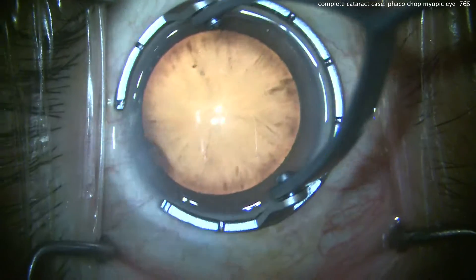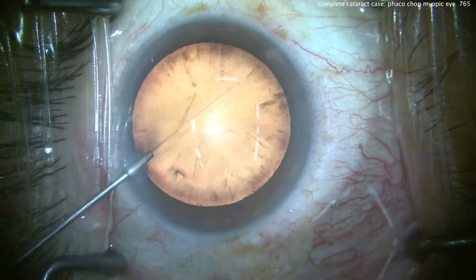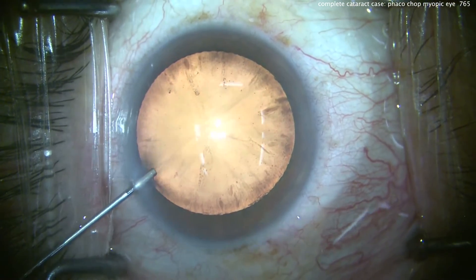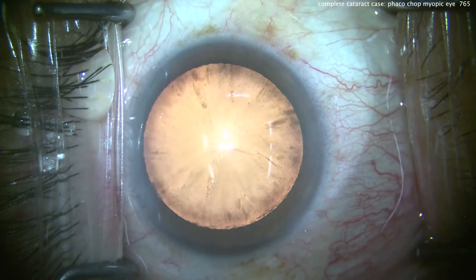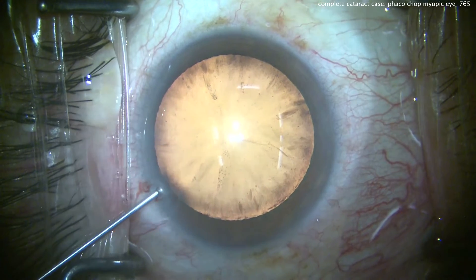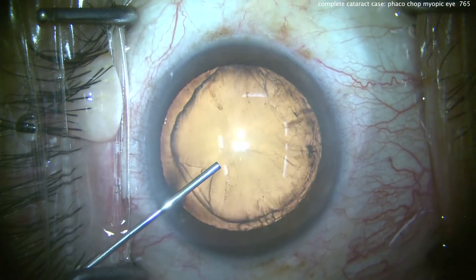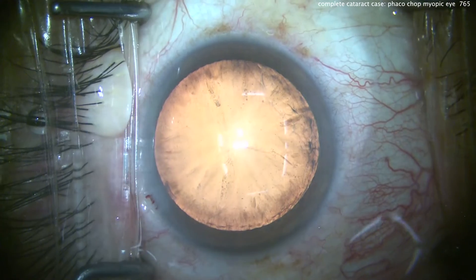There's the paracentesis. Look how big the eye is compared to the fixation ring — that cornea has a 13mm diameter. There's anesthetic being placed in the anterior chamber and the rest of it on the cornea. Now we'll get our dispersive viscoelastic and fill the anterior chamber. Look how much viscoelastic we need — that's a very large anterior chamber.